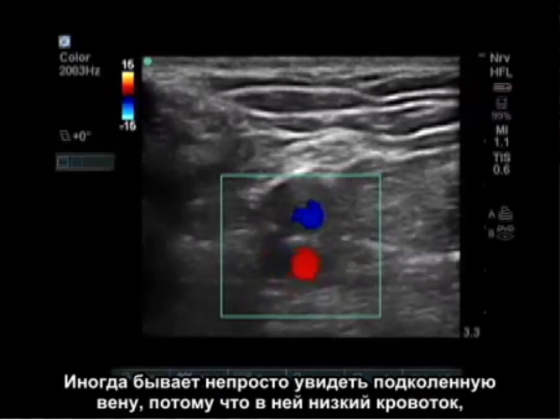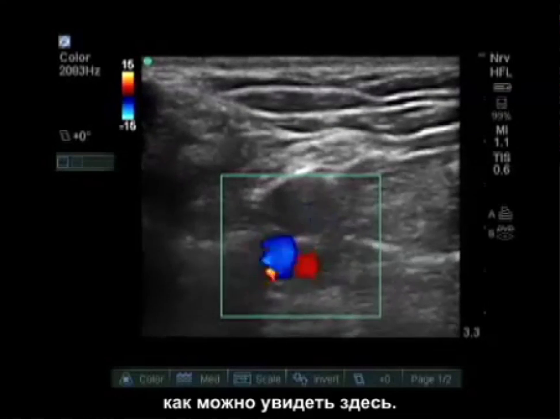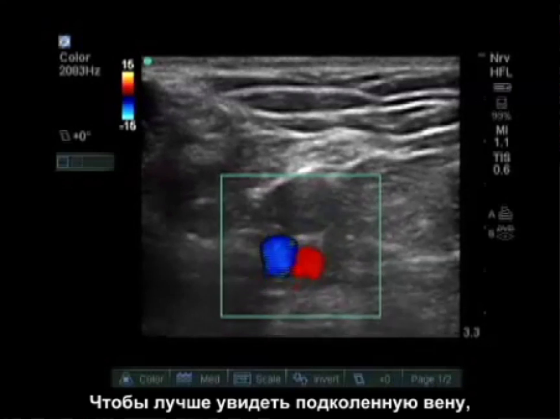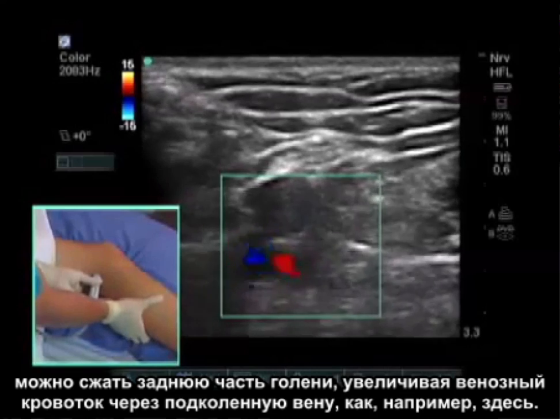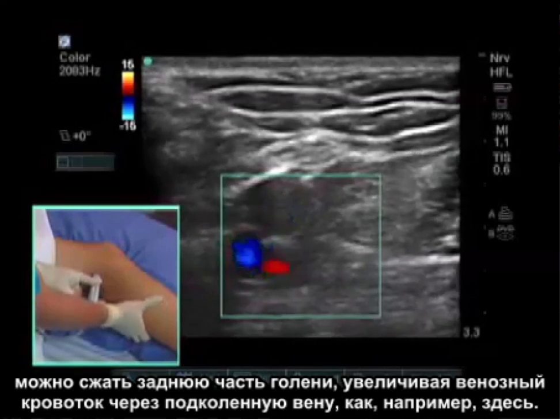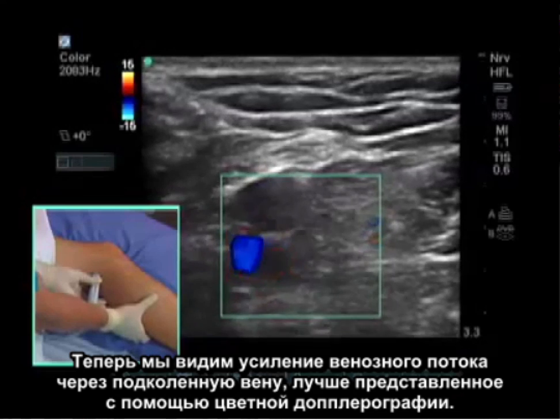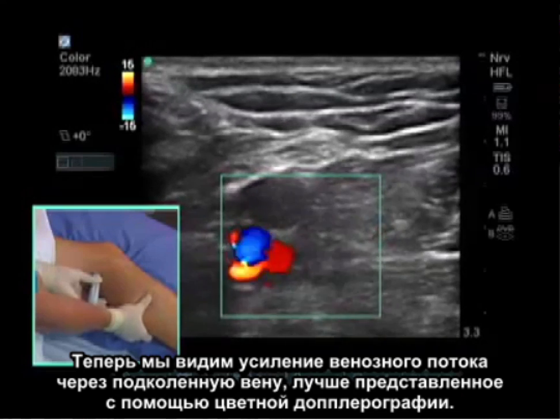Sometimes it's difficult to see the popliteal vein because this is a low flow state, as we see here. To visualize the popliteal vein better, we can squeeze the back of the calf, increasing venous flow through the popliteal vein. There we can see increased venous flow through the popliteal vein represented better by color Doppler.